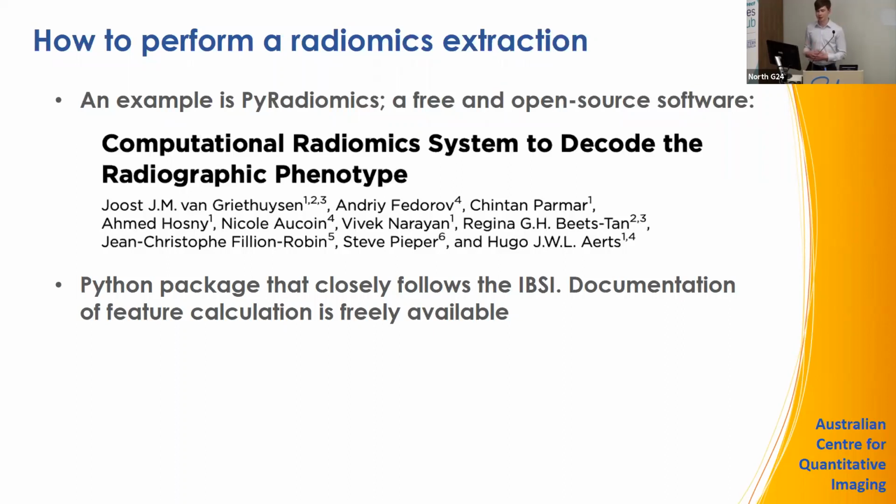So this is really useful as a researcher because I can just say, I'm using PyRadiomics to calculate my features. It follows the IBSI, and the calculations of the features are documented at this link here. And that's all you have to do as a researcher. So if someone else does the exact same thing, then you really don't have to worry about anything else.